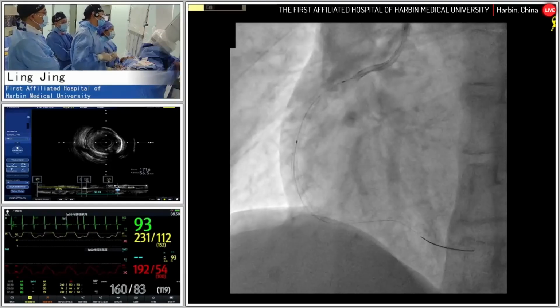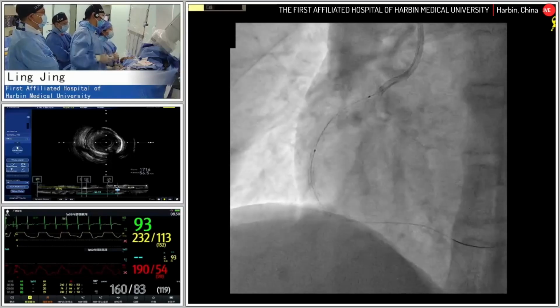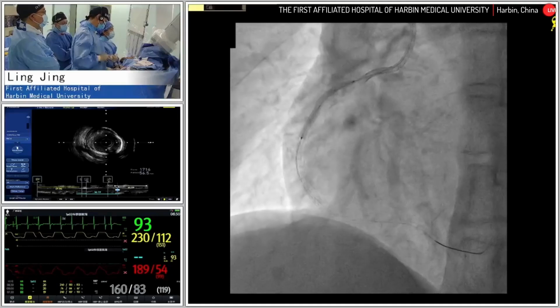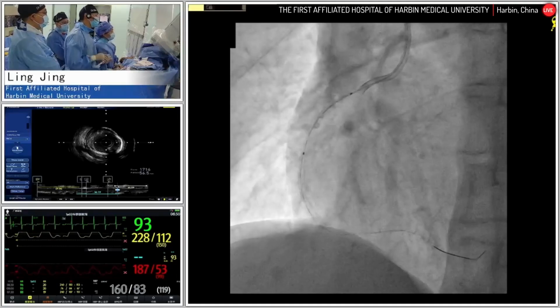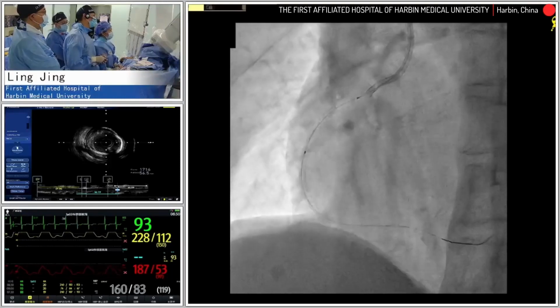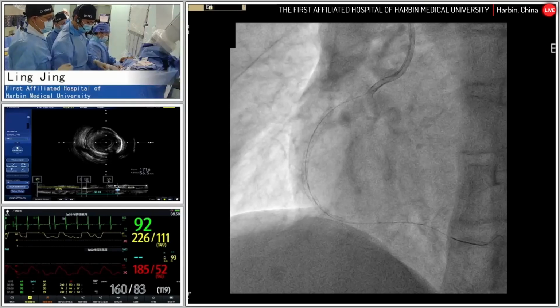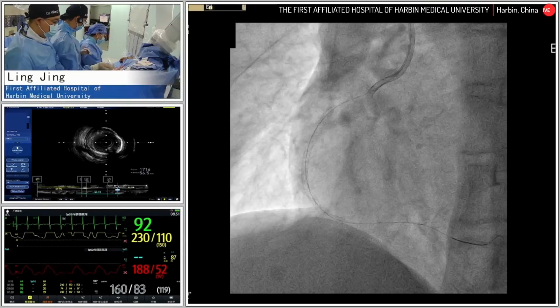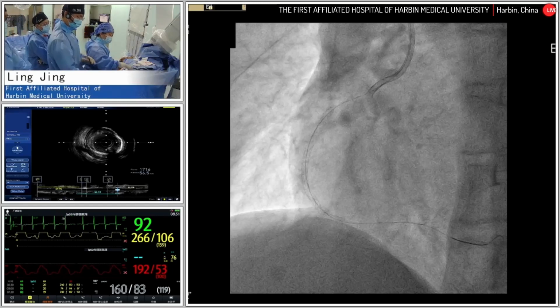After the first guide wire has passed through the lesion successfully, and the other devices, for example the 1.0 balloon, cannot pass, we can try to use the second wire to send along with the first wire as a landmark through the CTO segment, and use two small caliber balloons to dilate the CTO segment one by one.